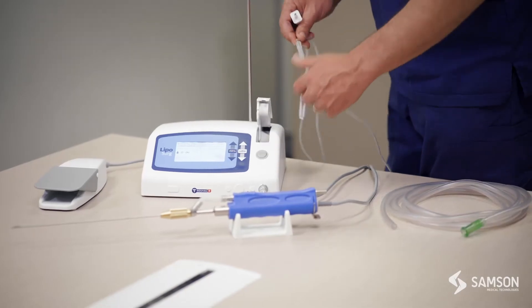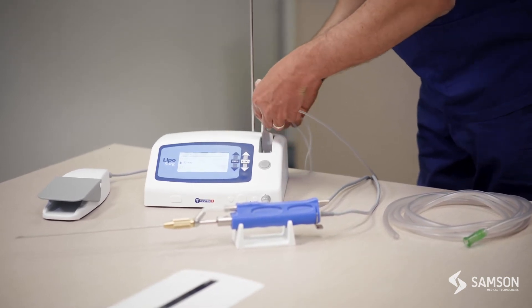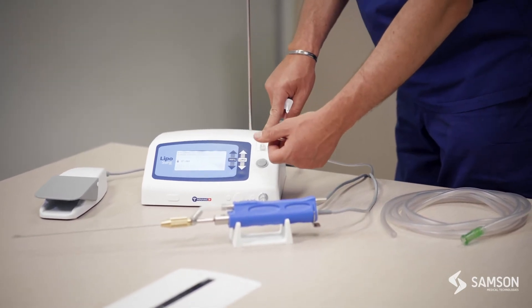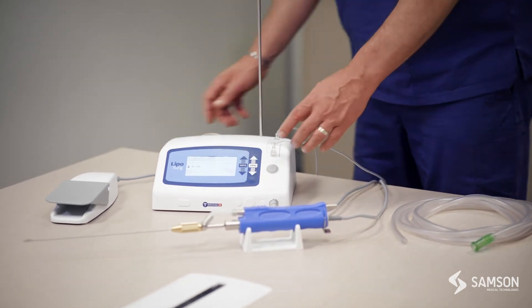To connect your infiltration tubing, we simply press the grey button, then slide the infiltration tubing to the top and connect it to the bottom. We then simply close it — make sure that you hear a click — and it is then ready to go.